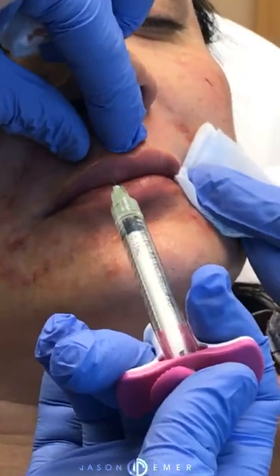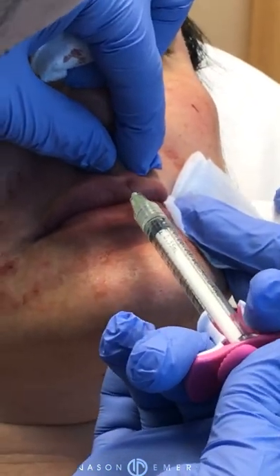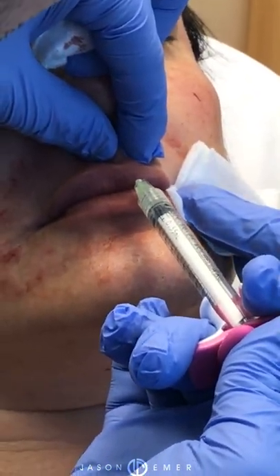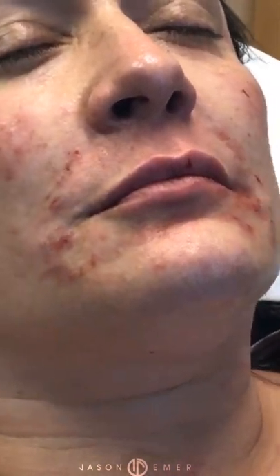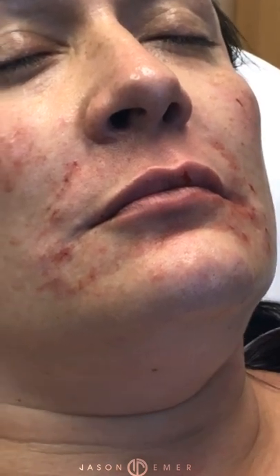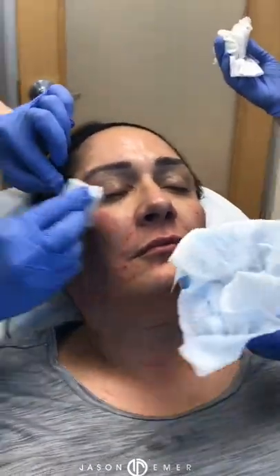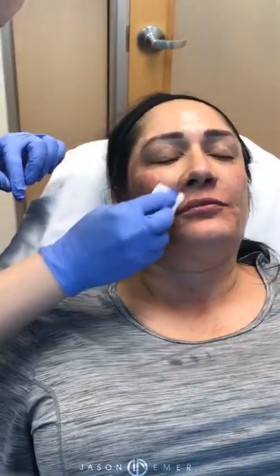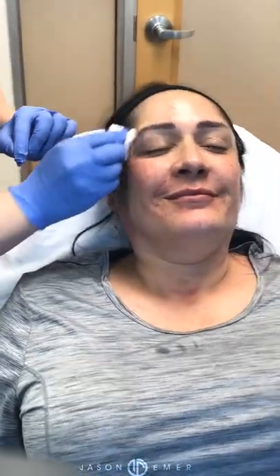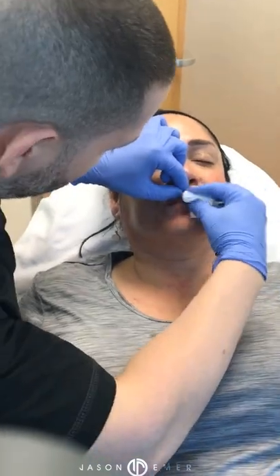And then lastly, she has a nice Cupid's bow, a little at the top on both sides of the Cupid's bow. Perfect. That accomplishes a nice amount of enhanced facial shaping. Let me just wipe her down so I can at least show her real quick. Then we'll ice. Obviously, it doesn't look like what it's going to look like long term, because she's going to be swollen and red and have blood. But once it settles, she'll be able to see everything. So I'll show you guys as well.